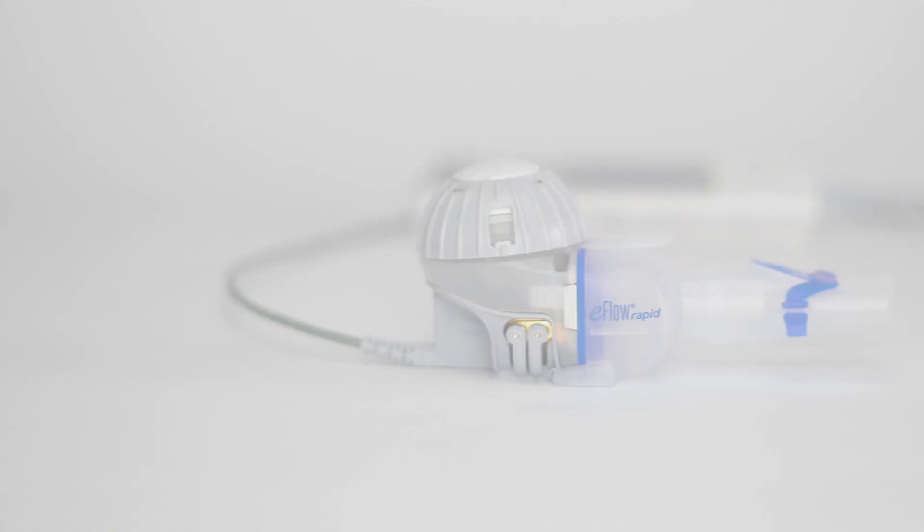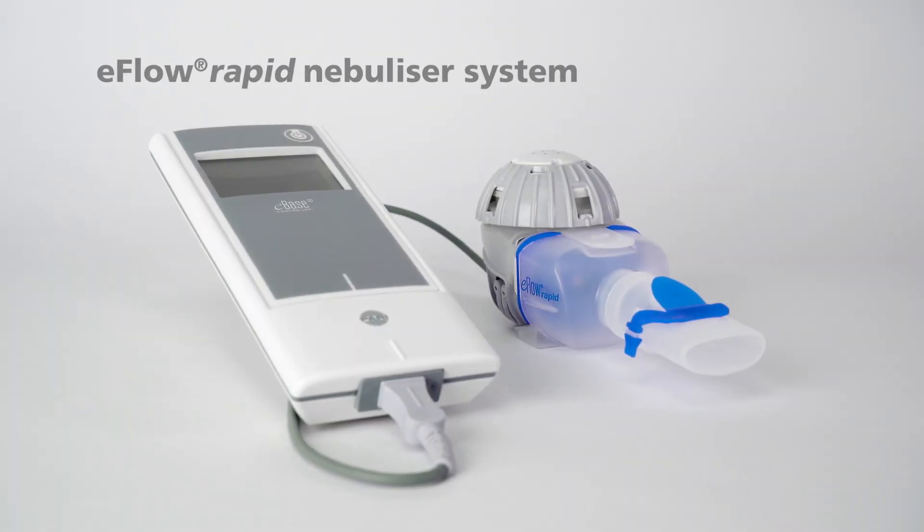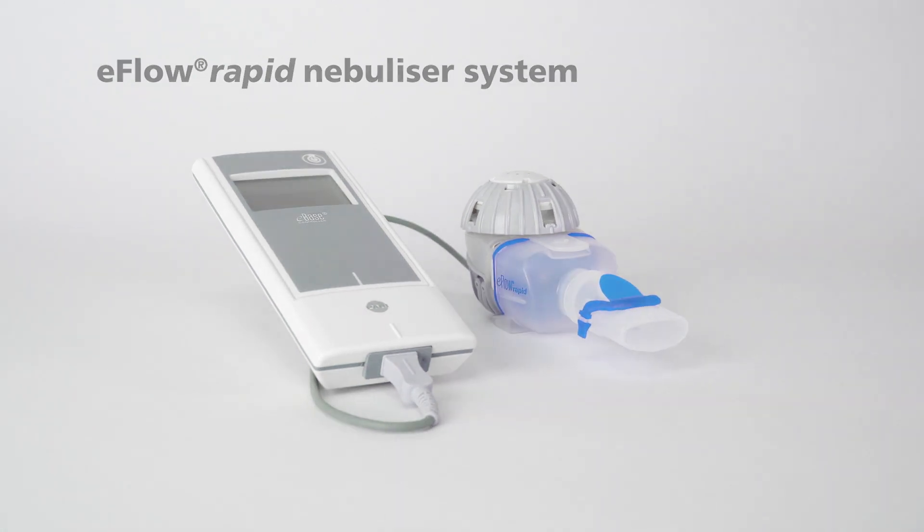The eFlow Rapid Nebulizer system is suitable for the treatment of diseases affecting the lower airways in all age groups: babies, children and adults.